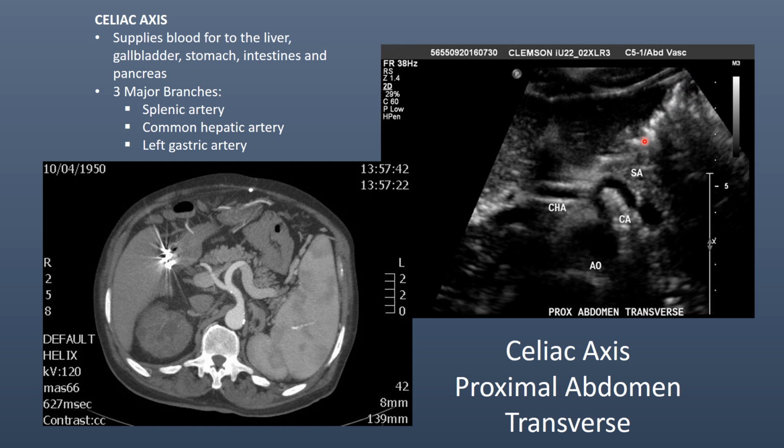Also want to point this out. This is one of the things we have to fight in the abdomen. This is bowel gas. So when ultrasound hits air, it just scatters and makes this foggy type image that's very difficult to see behind. That's something the sonographer has to be aware of when they're dealing with abdominal imaging, and we have to work around this, and we'll be talking about that in other tutorials within this learning module.